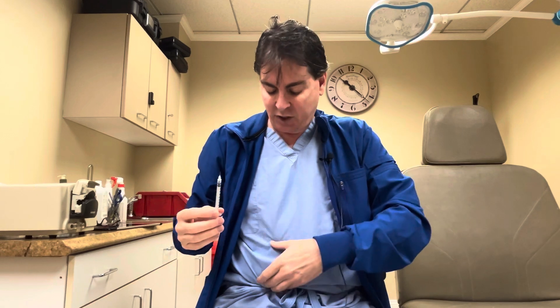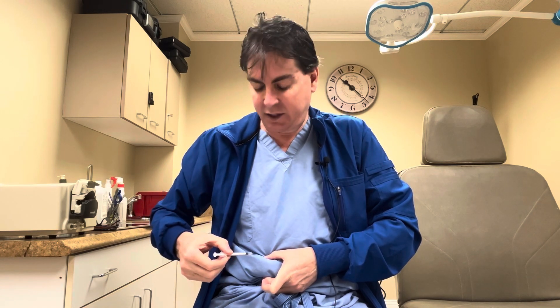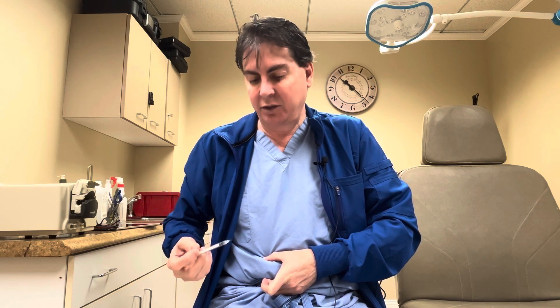Now you have your syringe ready to inject. The key is when you inject — whether in the right or left lower abdomen — you want to pinch. Pinching takes away any discomfort. Stick the needle all the way in, inject the product, hold it there for three seconds, and then you're done.